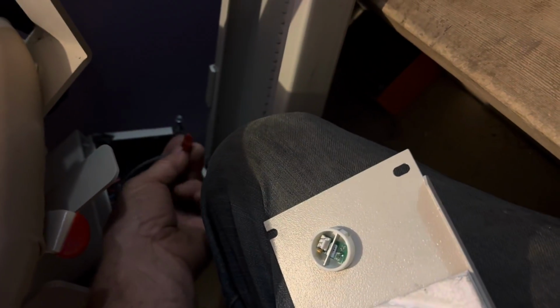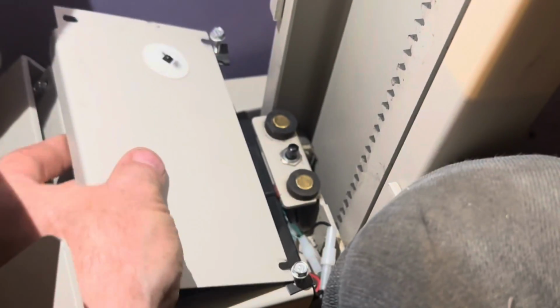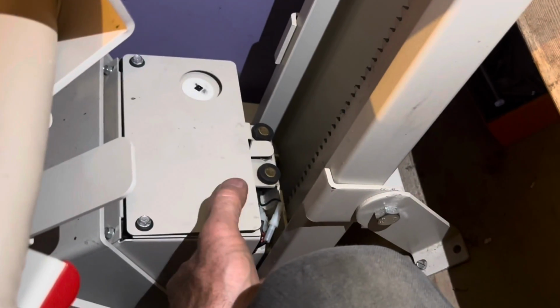We'll connect up the bumper next. Slide the bumper in place. Tighten up the bolts. Top plate that hits the switch down here. Tighten up those bolts. Make sure that the bumper plate still works.